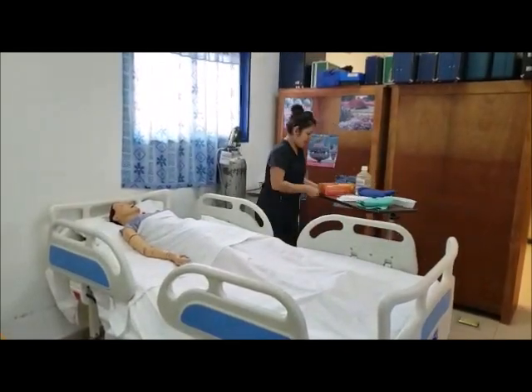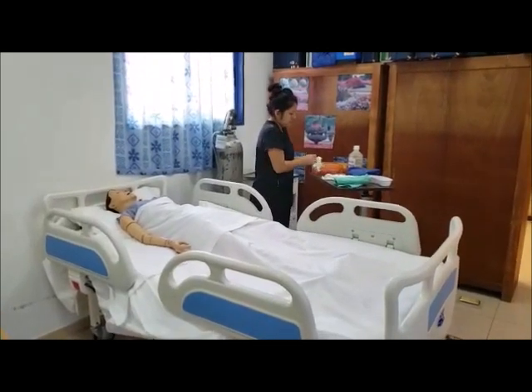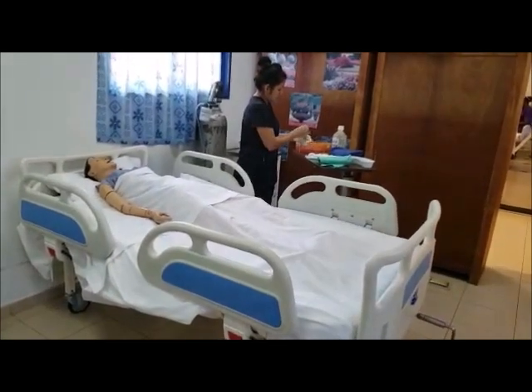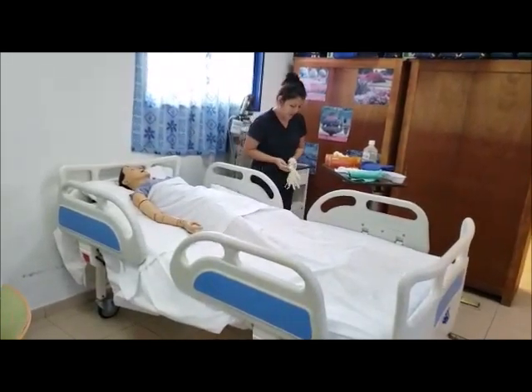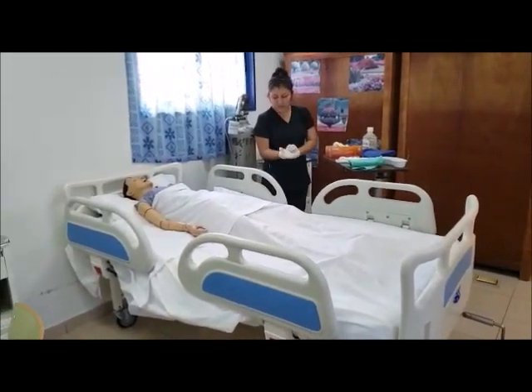Okay, I'll put on my gloves. Have you been feeling any discomfort today, Mr. James? No? Okay. Well, throughout the procedure, if you feel anything, just let me know, okay?